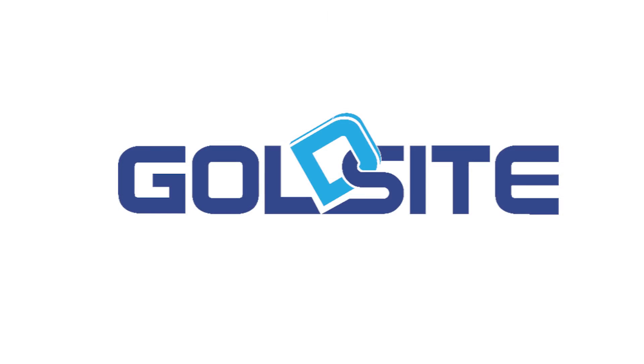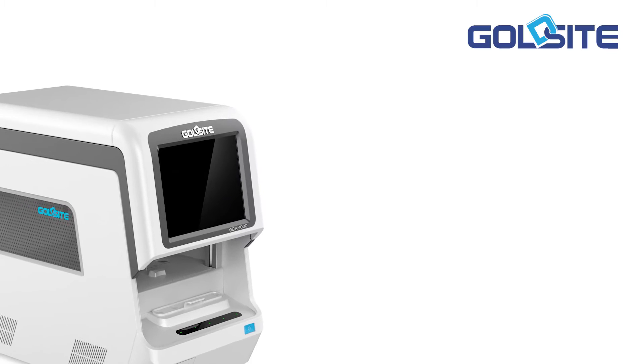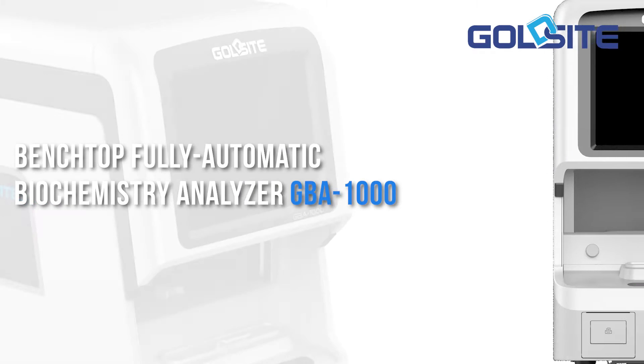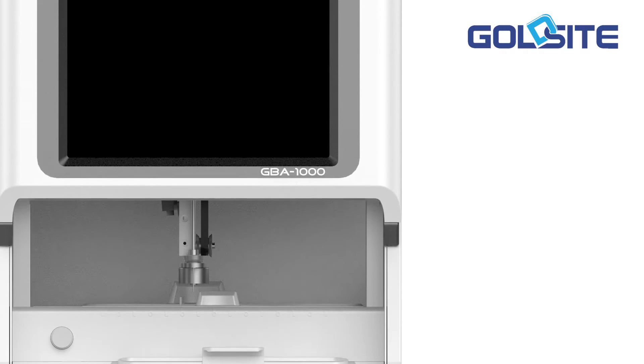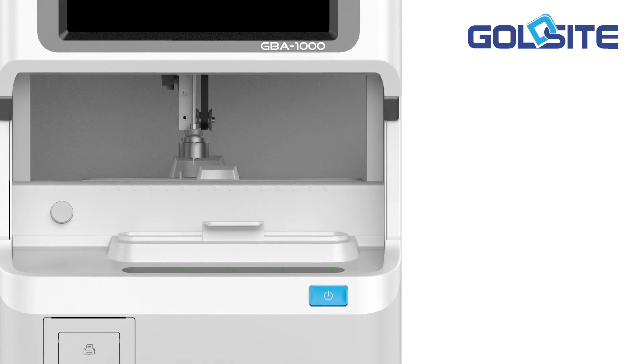Goldsite Diagnostics Inc. is a professional IVD manufacturer who has a vision to make a contribution to global healthcare. The latest benchtop fully automatic biochemistry analyzer GBA-1000 has maximized the R&D accomplishment Goldsite has reached in an accumulation course of time.